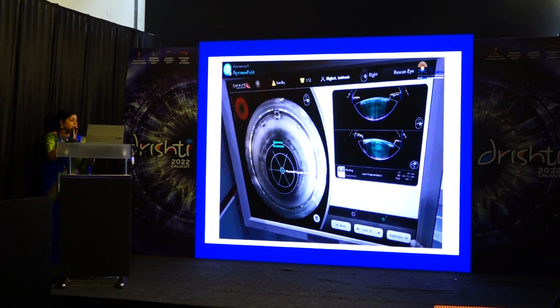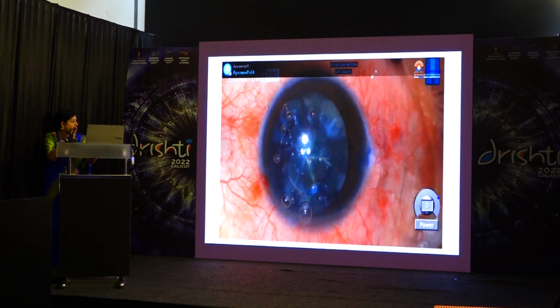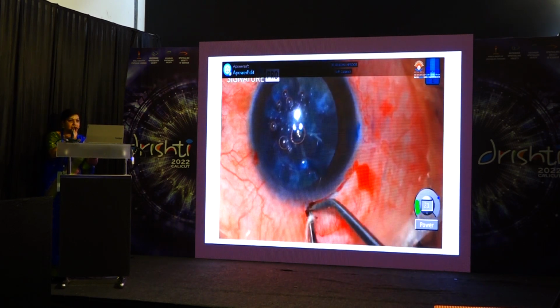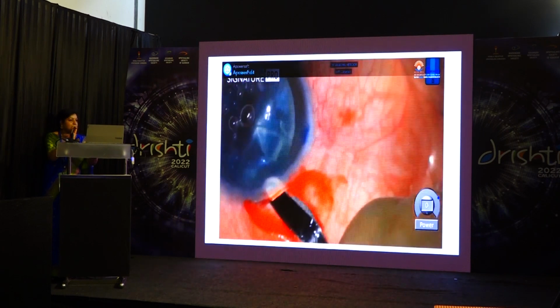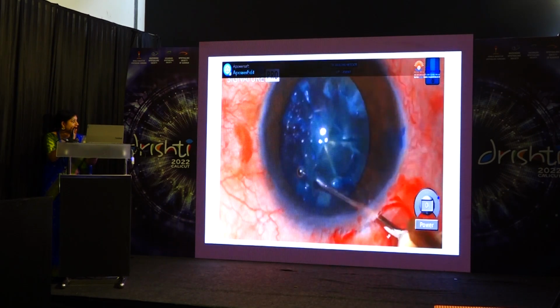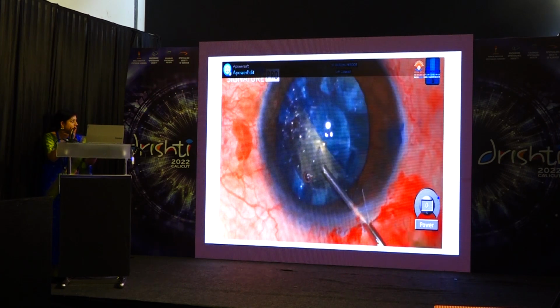But fortunately, when you see now during the surgery, again we stained it first, and we did it with a scleral tunnel because there was an 18-cut RK, and we didn't want to do a limbal one for the fear of opening up of the incisions. And now we are removing the capsulotomy flap. Fortunately, it was a complete capsulotomy, as you can see here.